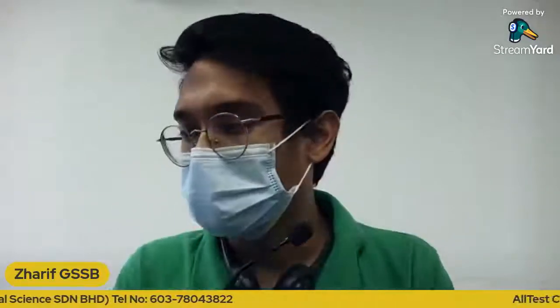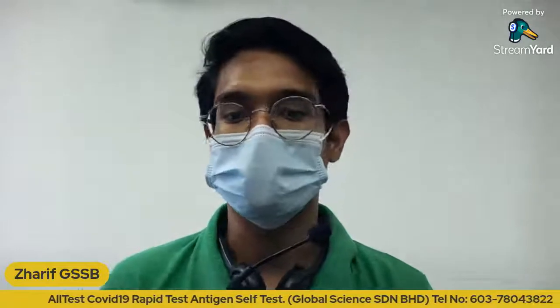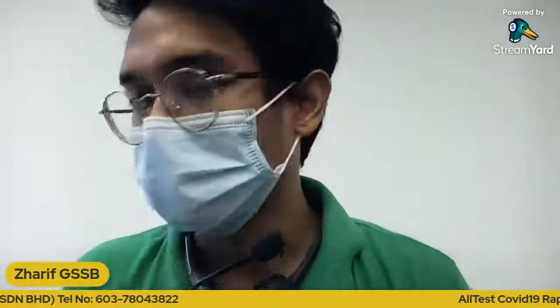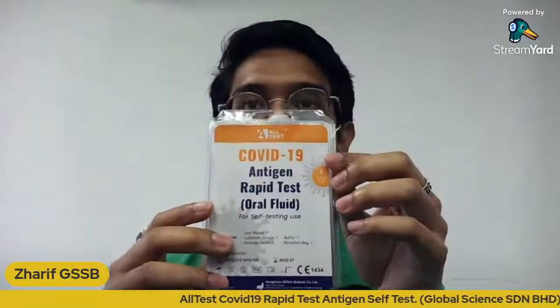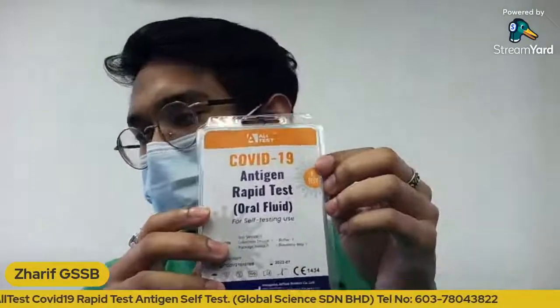The difference between pro-test and self-test is that the pro-test can only be used by professionals. To simplify, it can only be done at the laboratory by specialists like doctors or lab technologists. So if someone is trying to sell you the pro-test, please make sure not to buy it. You can only buy this one from certain pharmacies, which is for the public.